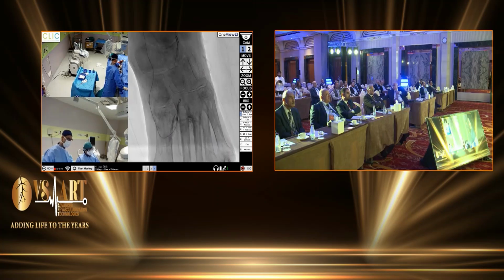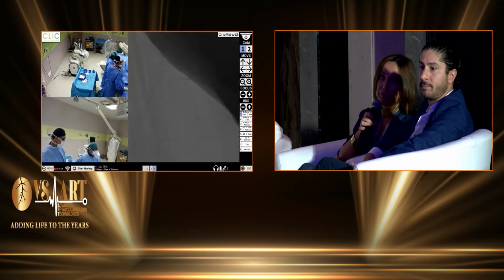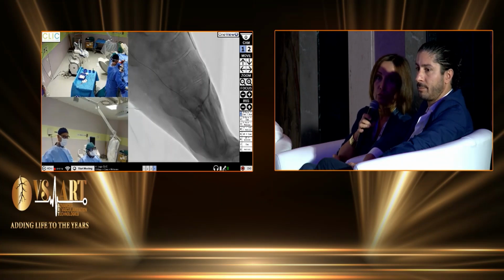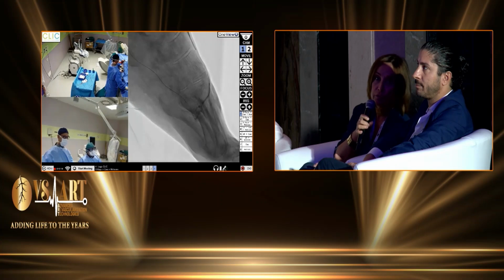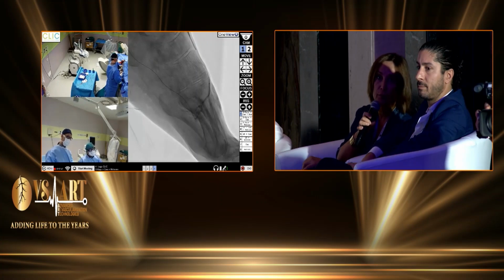So it is probably something related with the first generation of drug-eluting balloon and how drug was in the balloon, because it was like embolization of the drug, isn't it? Yeah, unfortunately, with drug-eluted balloon, we have a problem also with the carrier of the drug itself. So most probably there's something that can be overpassed with a completely different drug than paclitaxel. So maybe with Limus gonna be better, and also the carrier for this kind of drug will be different. We will see also with new supportive, new carriers that are coming on the market, and regenerative medicine too. So let's see what's going to happen in the next few years.